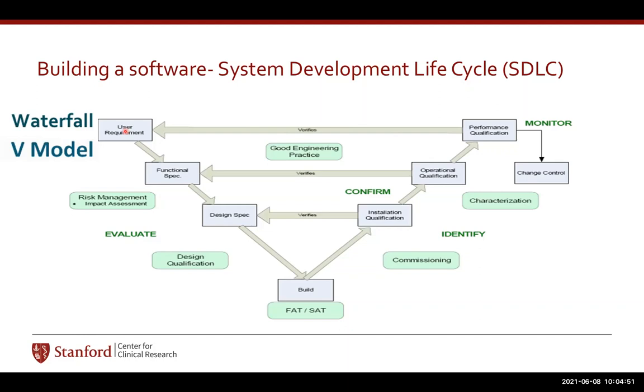Either you can do automated testing, where you code your requirement into the test. I had been involved with that when I was testing the SAP system and creating the user requirement, and then the script is generated to test the SAP system. But that is one of the examples.